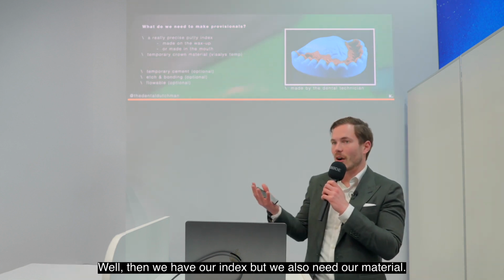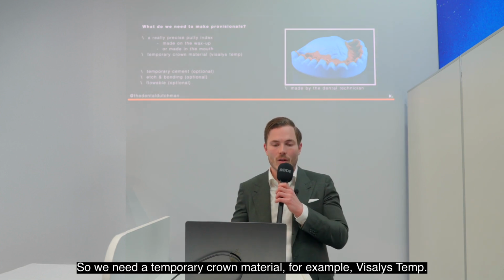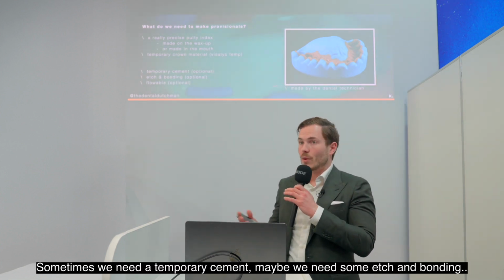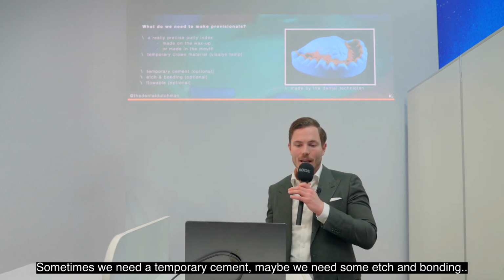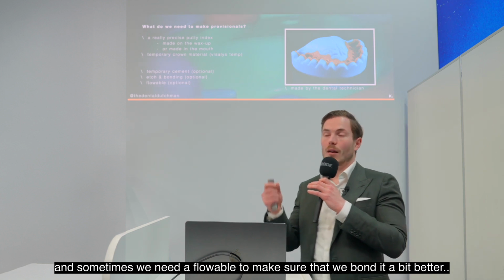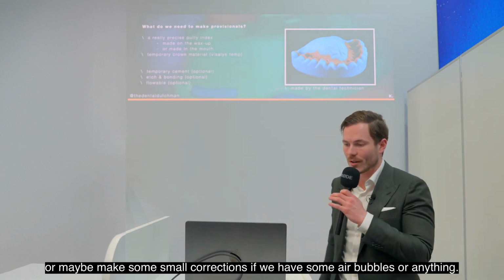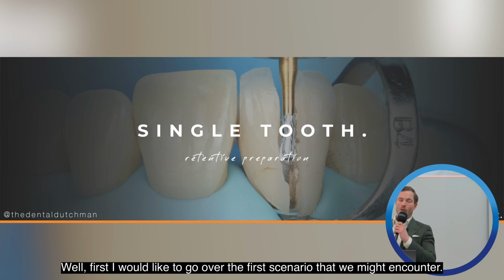Well, then we have our index, but we also need our material. So we need a temporary crown material, for example, Visalys Temp. Sometimes we need a temporary cement, maybe we need some etch and bond, and sometimes we need a flowable to make sure that we bond it a bit better, or maybe make some small corrections if we have some air bubbles or anything.